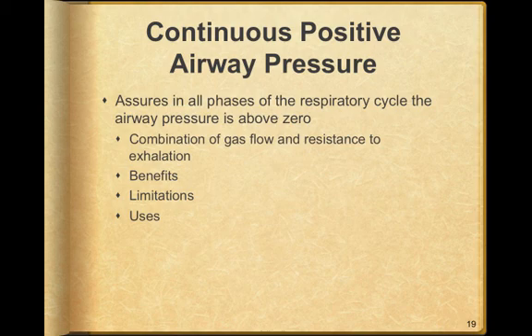Benefits of this are more airflow, improved oxygenation and ventilation, improved diffusion, and greater gas exchange on the surface area. Limitations are that it does not provide any kind of positive pressure ventilation, and no difference in gas flow between inhalation and exhalation. The effects are limited to the alveolar and small airways, and CPAP has been used in various situations, including COPD, asthma, any kind of pulmonary edema at all, and it's relatively simple to use. And this is skill 22.1 in your book.